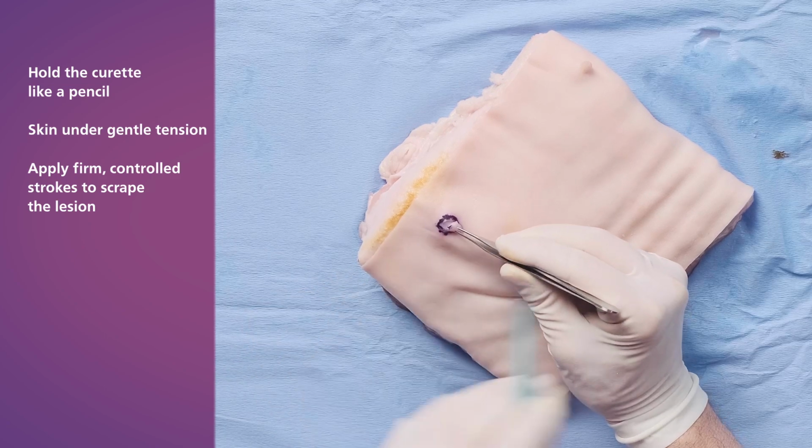It is important that you only use the blunt end of the curette. Tumour tissue is friable and it should peel away from the healthy dermis. The sharp end of the curette doesn't make use of this difference in friability to either identify the margins of the lesion or minimise the amount of normal skin damaged.